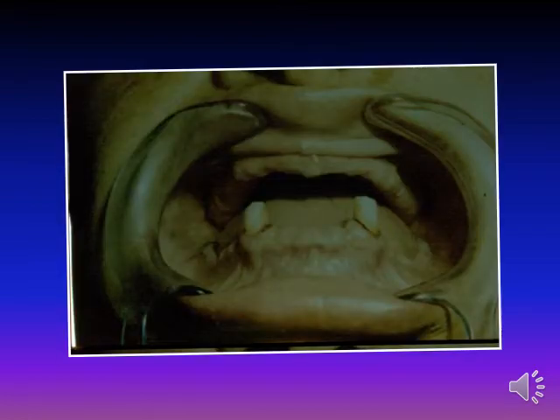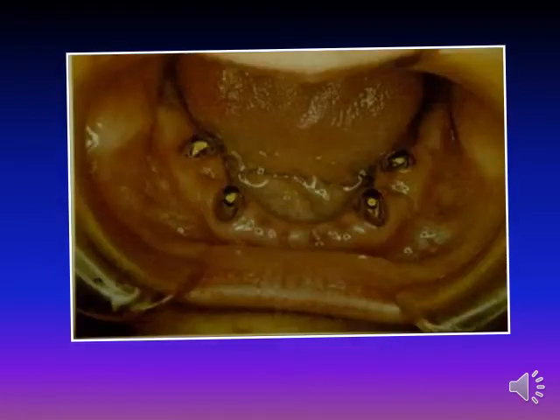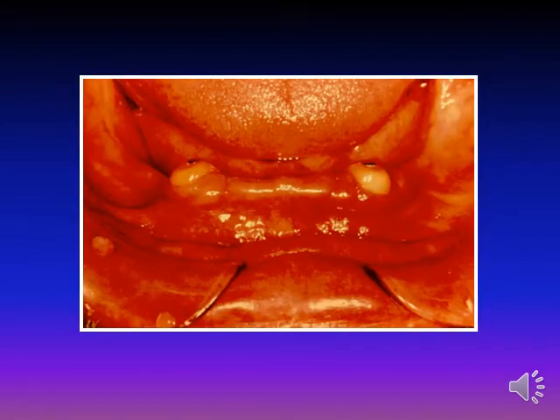Here, two canines, but with periodontal involvement and must be treated before. This also two canines, better than the other slide. This abutment preparation with coping. This long coping and short coping. This is with amalgam plug.